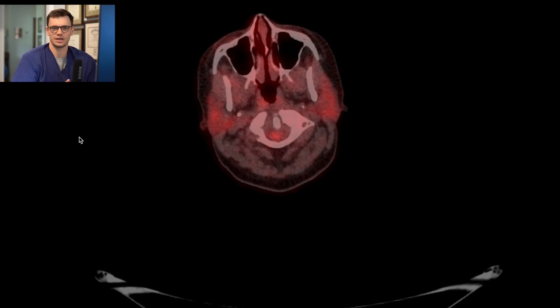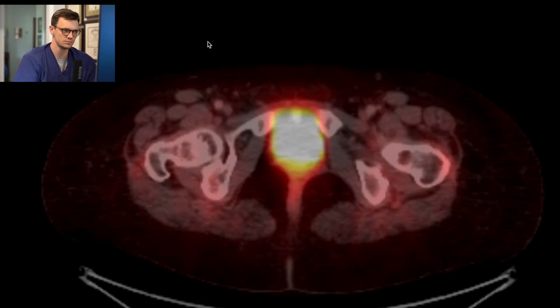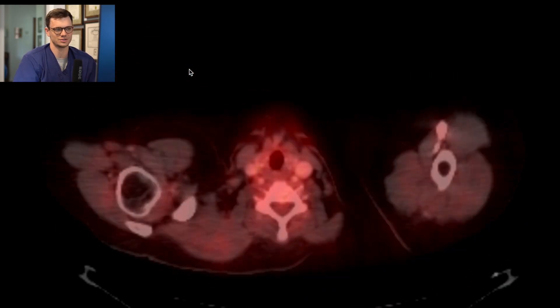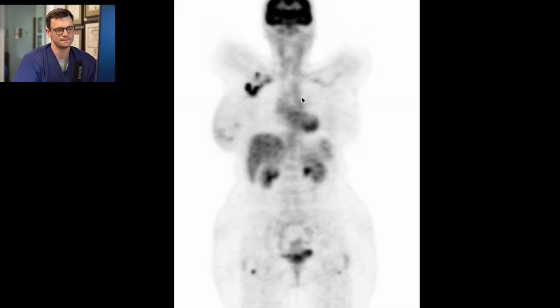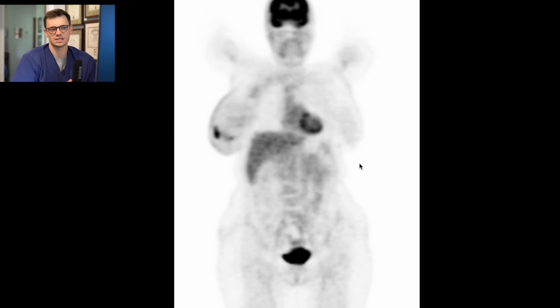I want to show you briefly a case that's very positive so you can get a sense of what tumor looks like — what increased FDG uptake beyond normal physiologic uptake looks like. This is a patient with recently diagnosed breast cancer. Let's pull up the MIP image. First thing I want to draw your attention to is the right breast — there's some activity that looks a little hot compared to the left. We also see what are probably axillary lymph nodes. We'll confirm on the actual scrollable images. That's the main thing I see.